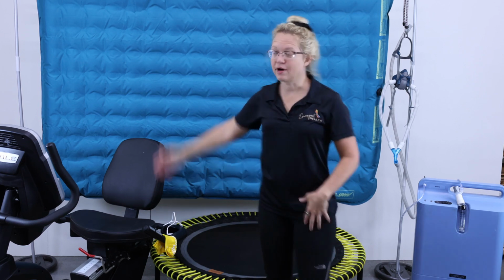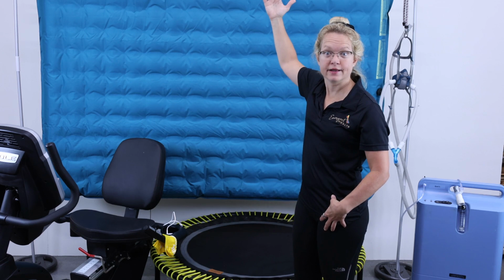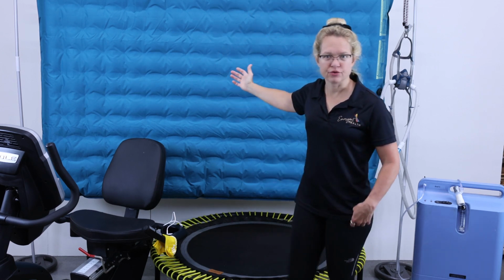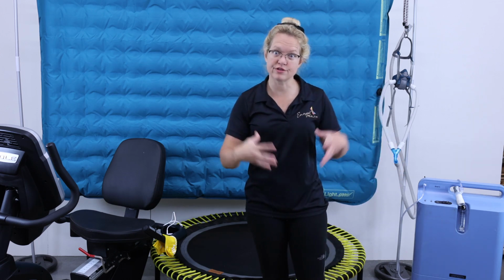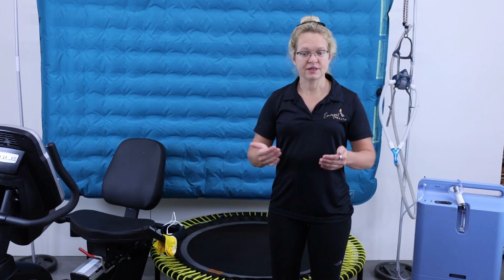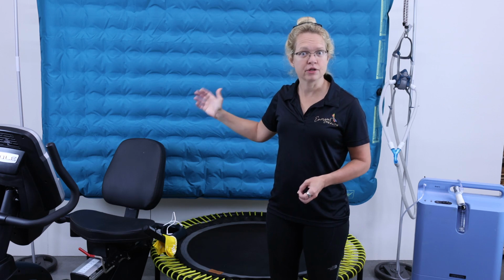For this video, I have it set up right here so you guys can see it. But normally I would hang it above my head so it's out of the way. The reason I chose this particular inflatable mattress as my oxygen reservoir, to hold the concentrated oxygen, is because it is made out of a TPU lined polyvinyl.